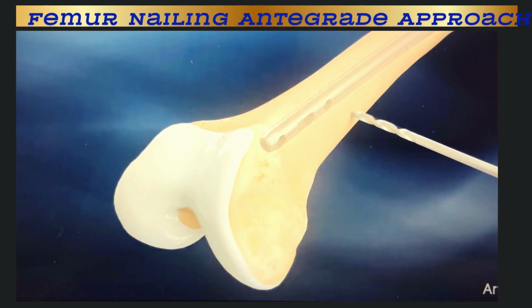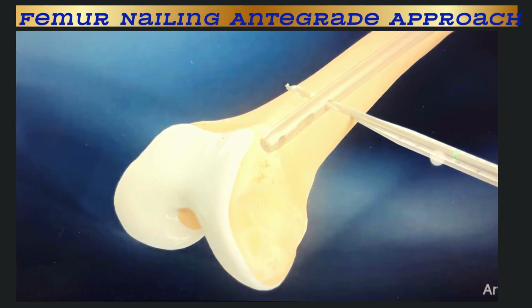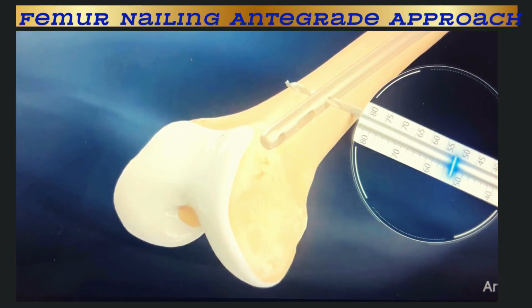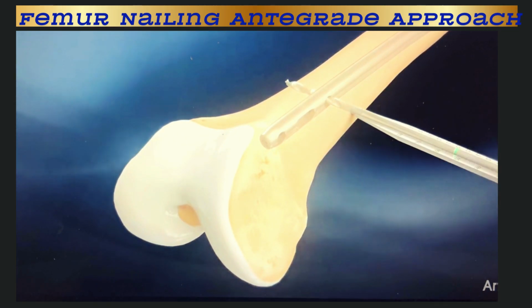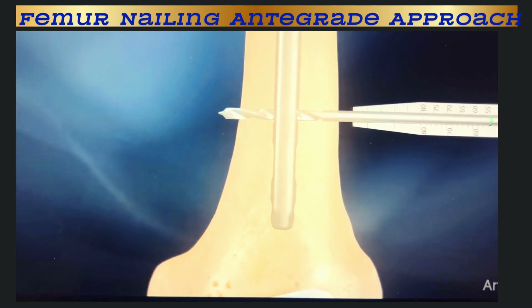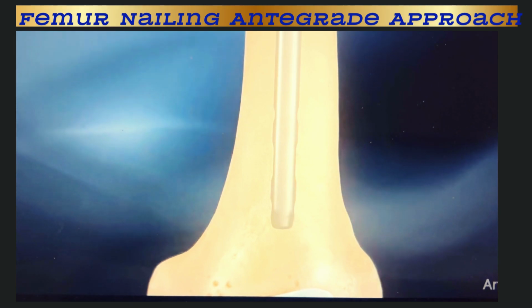Using a perfect circle technique, drill bicortically in the distal femur with a 4 mm drill bit. Fluoroscopy can be used to assist. Screw length can be measured from the green line on the 4 mm drill bit reference of the distal depth gauge sled. Alternatively, a standard depth gauge can be used.